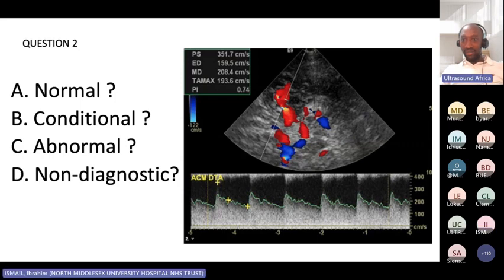Kindly repeat the distance of MCA from the probe. So we start with around 40 millimeters. Okay, 4 centimeters, basically. Generally, you can go slightly lower, but you have to have a starting point. So a good starting point would be around 40 millimeters.